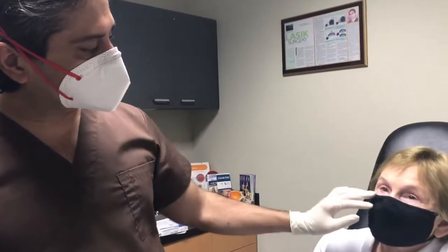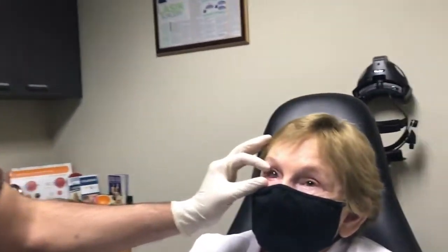This is Linda. She has a neurotrophic ulcer in her right eye, which is thinning the cornea as you can see here, with opacity present.